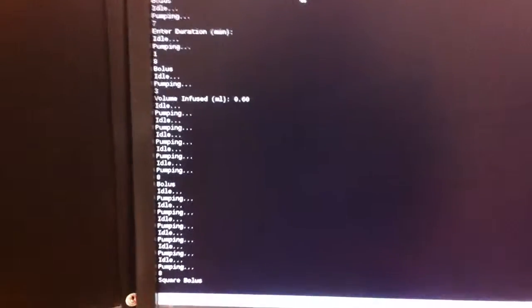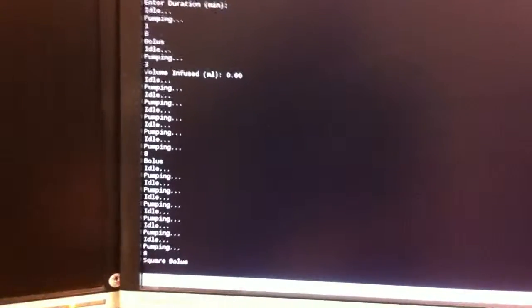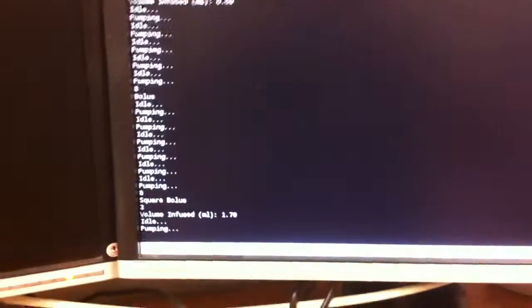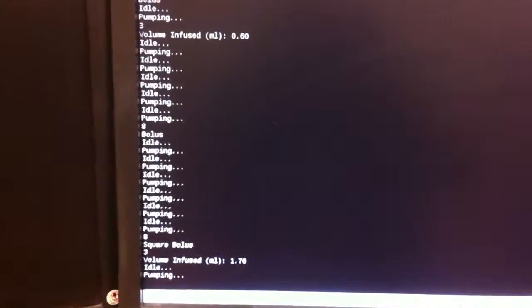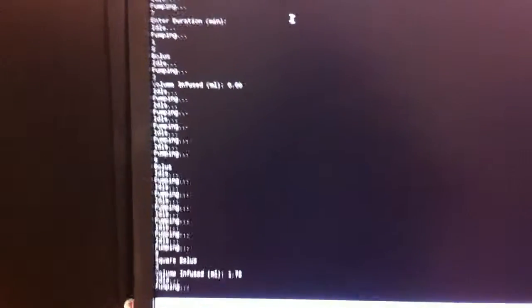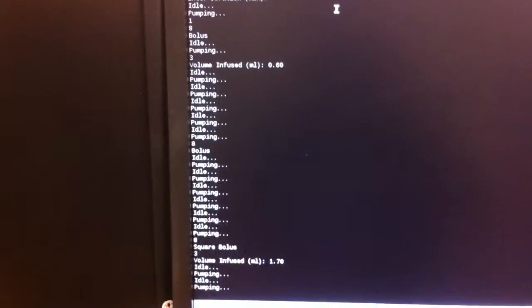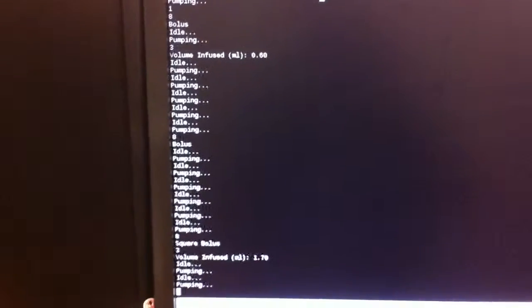Okay, let's check the mode. Oh, and now you see there's square bolus, so that means that the patient bolus is completed. And you can check it's 1.7 milliliters. So I believe after 3 more doses, it should switch into KVO rate. And then clinician intervention is needed in order to restart the pump, because there's a hazard that too much drug was delivered, and the clinician should make a decision what to do now.